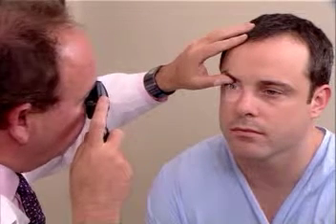The first thing that you'll notice is the red reflex. If a red reflex is not seen, one has to be concerned that there may be some opacity, such as a cataract, in the lens.